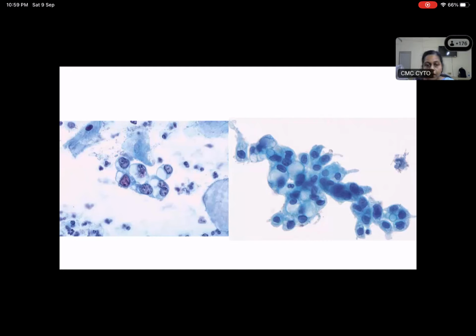Now, Rajiv, I also mentioned that this patient has been on IUCD. She's been wearing an IUCD, intrauterine contraceptive device, for the past 3 years. I just want to remind you all of that history. And in that context, can you tell me what you're seeing here? What cells are these? Glandular cells or squamous cells? These are glandular cells. Yes, they are glandular cells.